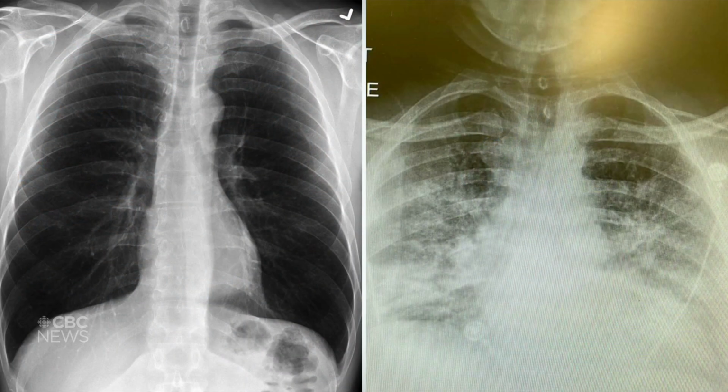Yes. I want to come back to that point. I definitely think we want to spend some more time there, but I do want to show one more side-by-side slide. So this is a patient who's a 48-year-old man. Again, let's look at that. Again, we see all of that white in the lungs, so all of that fluid.